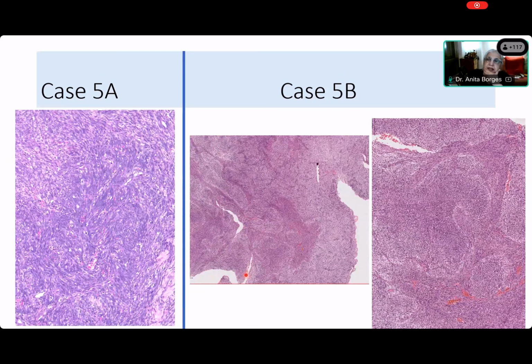Now tell me, are these spindle cells? Yes, ma'am. Very good. Pattern? 5A, they are arranged in fascicles. Yes. Okay. Ma'am, herringbone pattern. In a herringbone pattern? No, I don't think so. I just think that they're in fascicles.